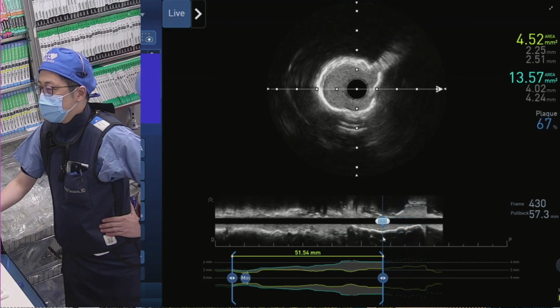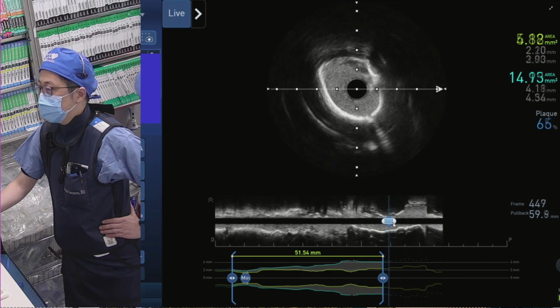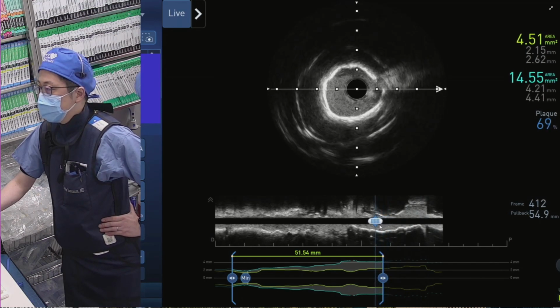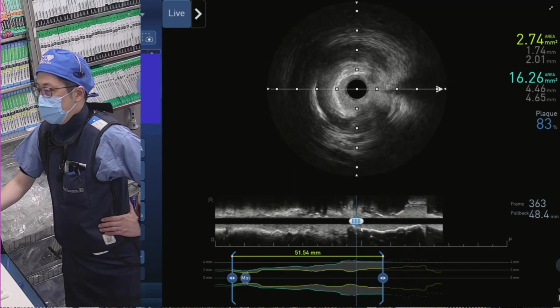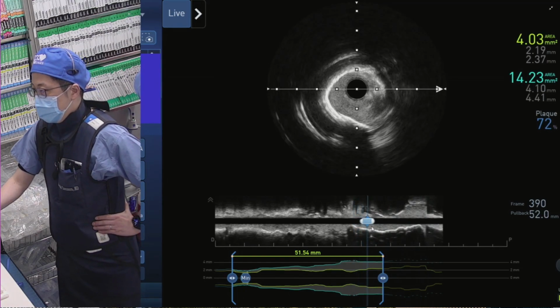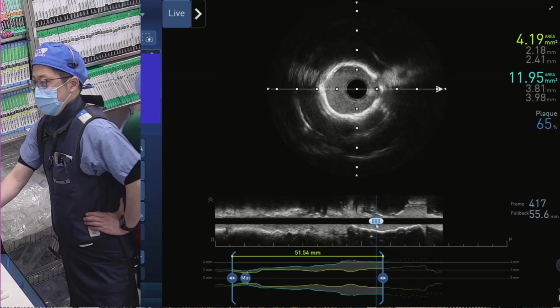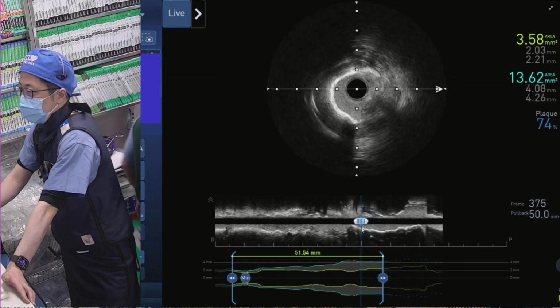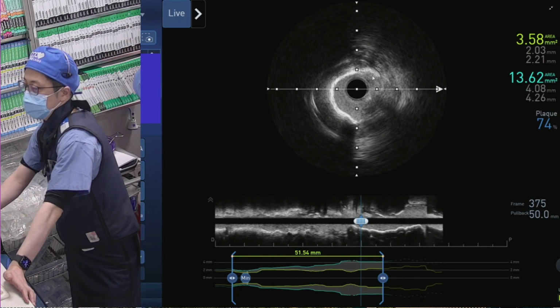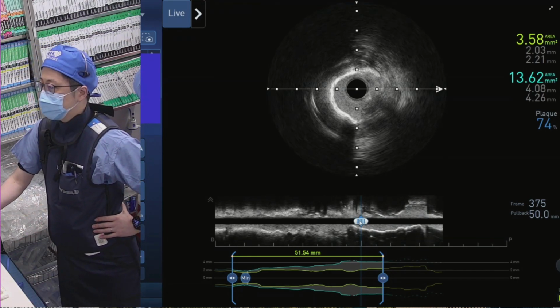It's going to be on the 360 calcium. So maybe the best size might be... do you see, I know IVUS is not the best, that you see at 4 o'clock, 5 o'clock, you see the calcium plate has been, I mean, it might be some dissection. Even the angio shows some haziness. It might be some dissection but because of the calcium artifact, we cannot see behind the calcium any dissection or something.